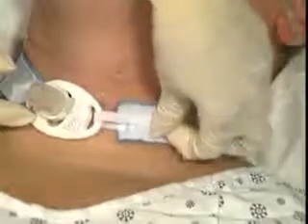Now remove the twill that was holding the tracheostomy tube in place. For your post-op patients, or where heavy secretions are present, you may allow a longer loop in the fastener tabs to help keep the neckband from becoming soiled.